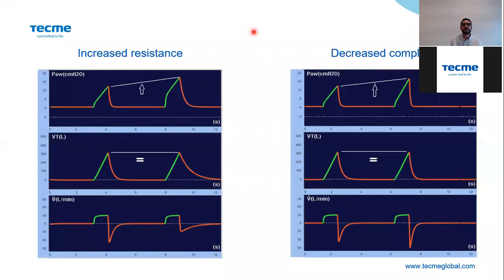And for example, if the compliance decreases, in this second graphic, it also will increase the airway pressure.